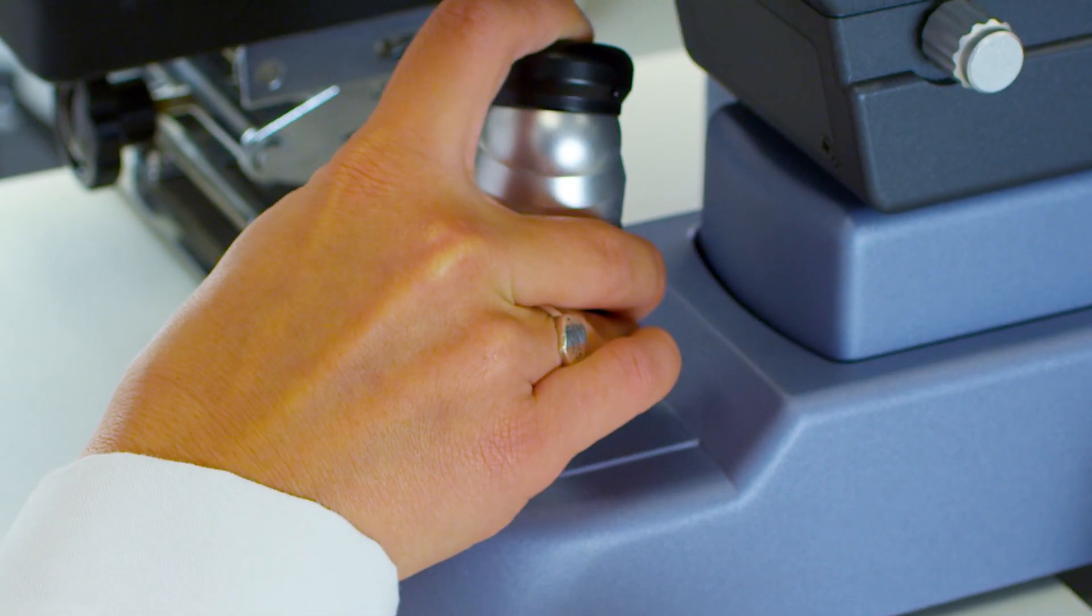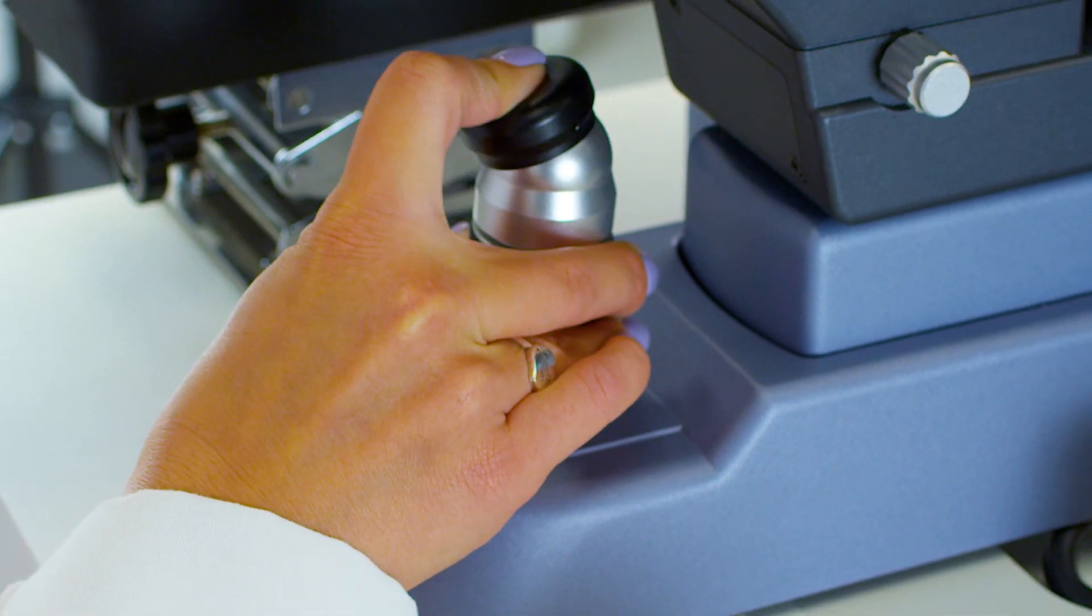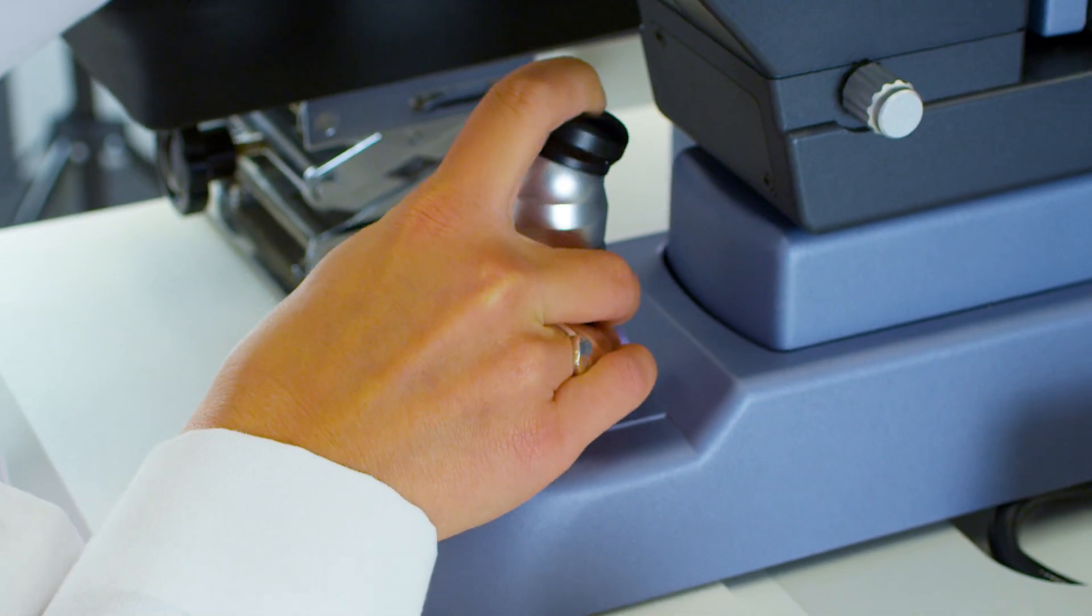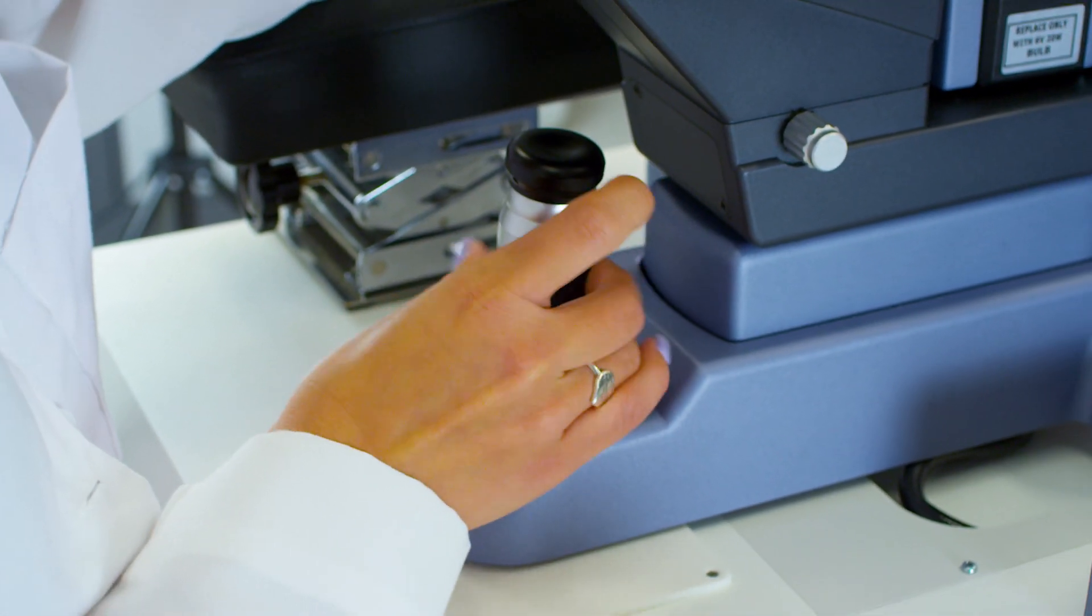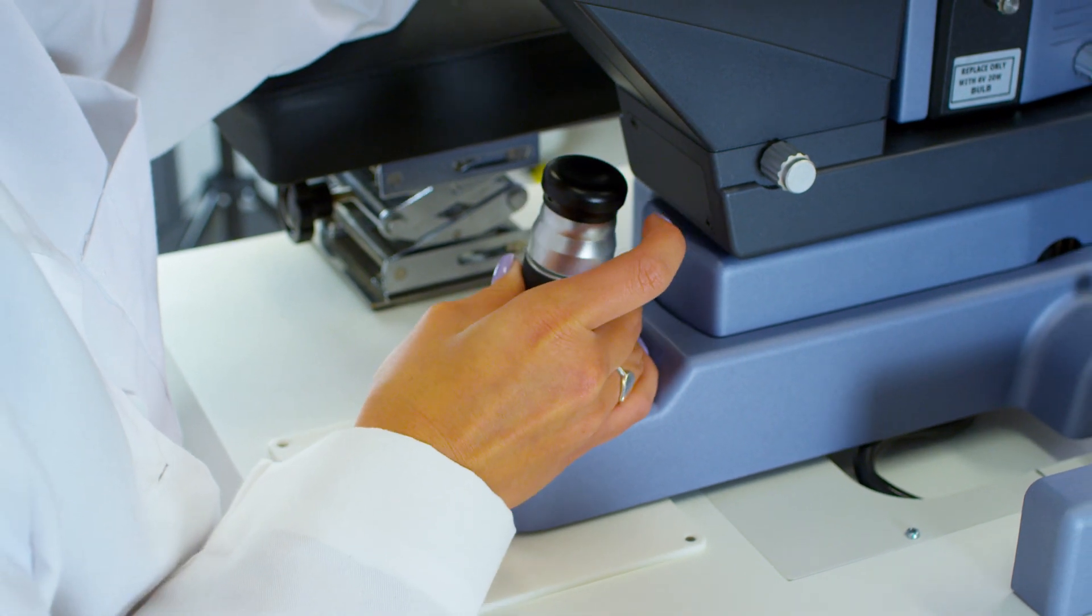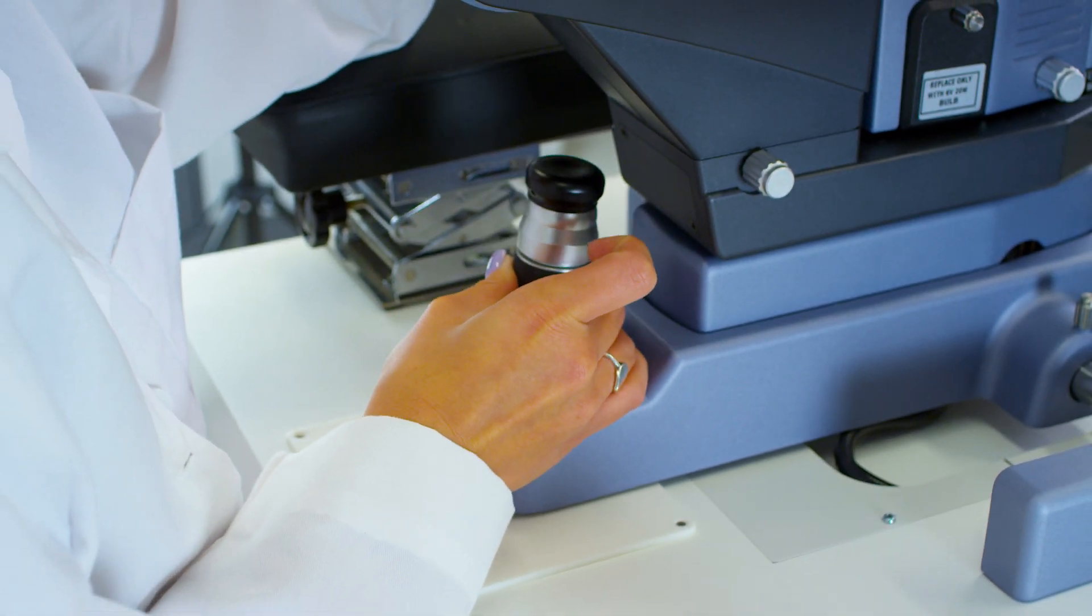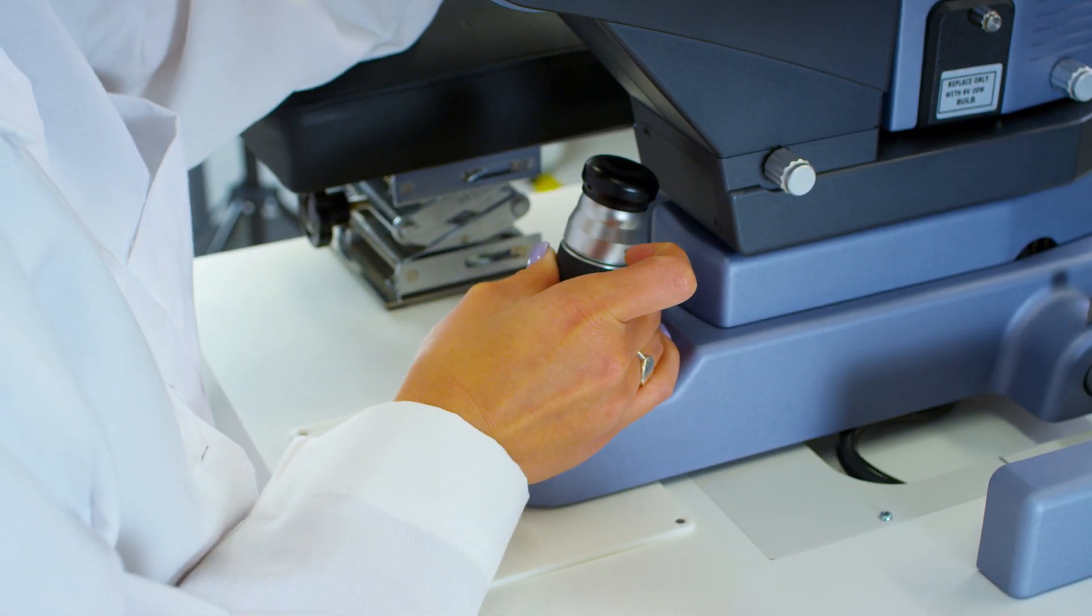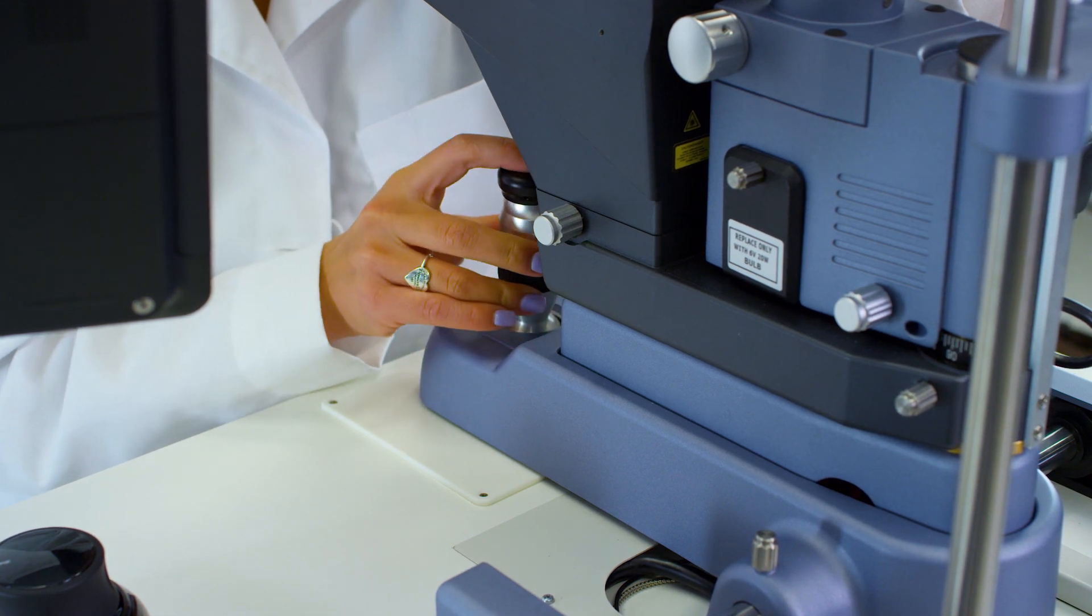The ergonomic design includes an integrated micromanipulator built onto the joystick for optimal precision. This provides easy application of confluent spots and patterns to improve outcome and treatment speed.